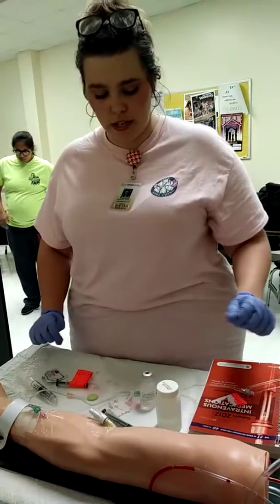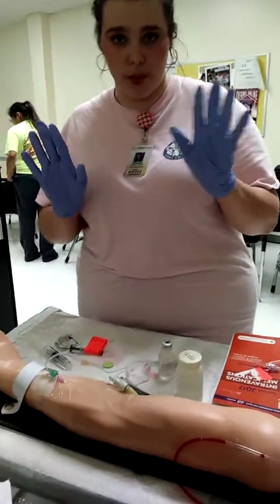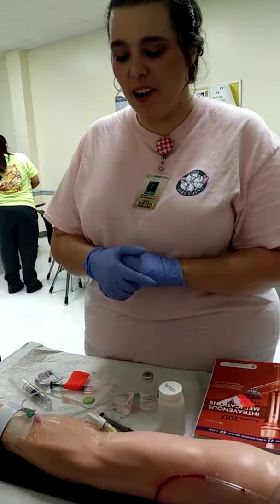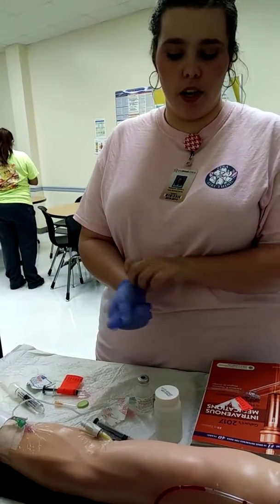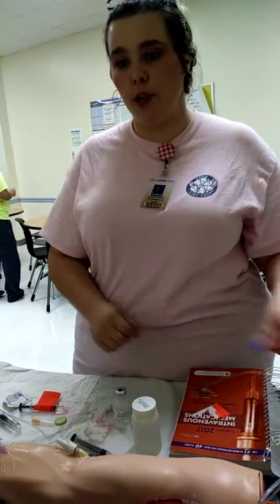It's all cleaned, and I have my gloves on throughout the entire process. So, make sure everything's fine. The patient doesn't complain of any burning or any symptoms like that. And I will document what I've done, and set the flow rate back to what it needs to be after I unclamped it. We're good, and that's it.